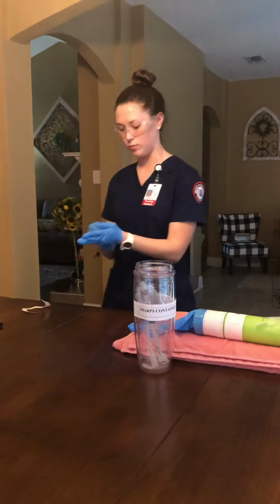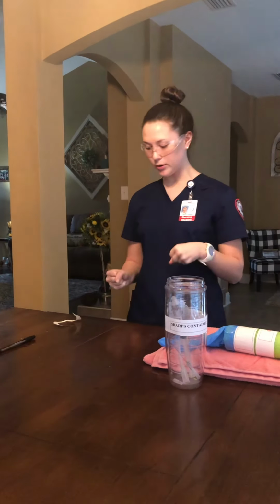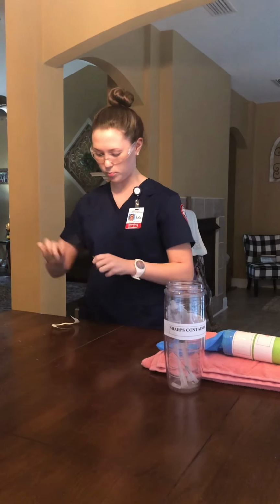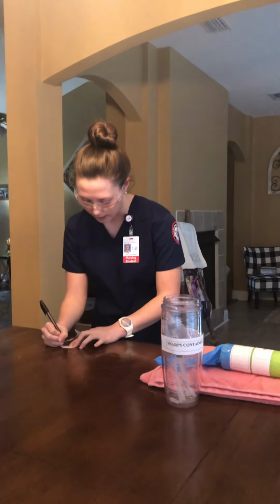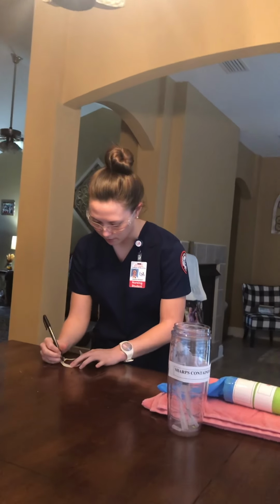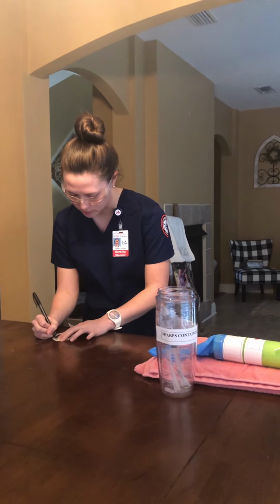And now I'm going to remove my gloves. So the next thing I would do is prepare the label. So I'm going to put the date, the time, my initials, and the gauge size, which is 22.